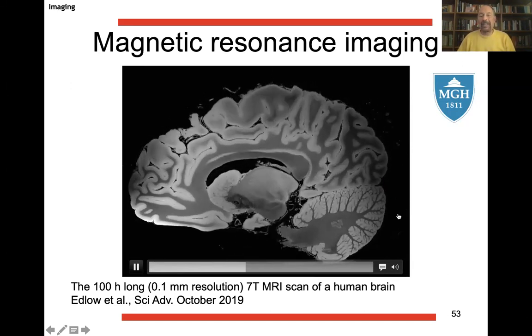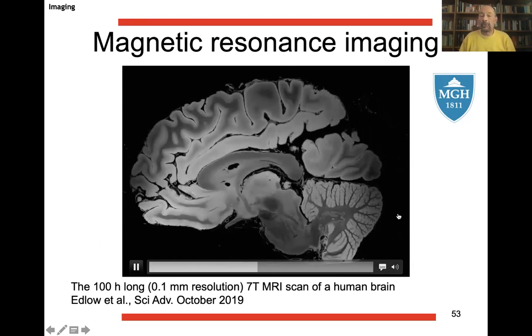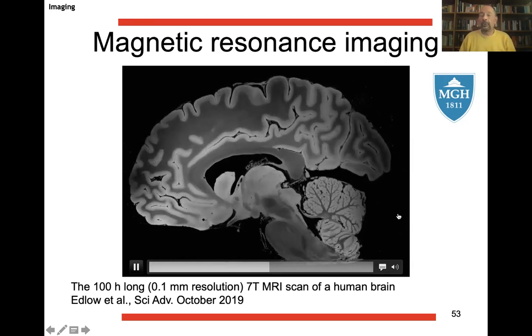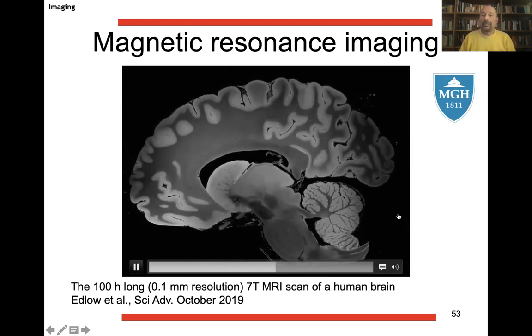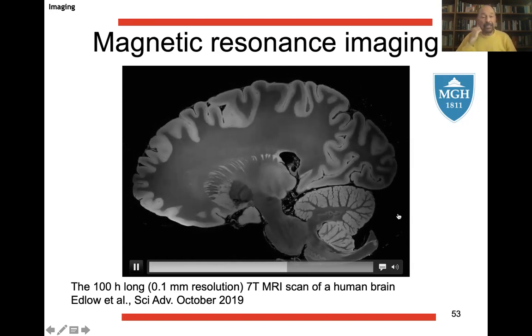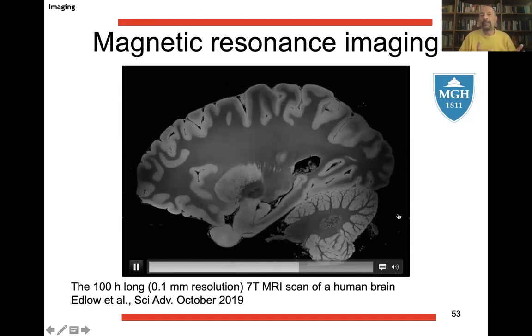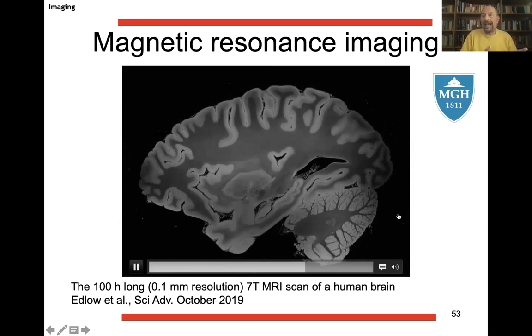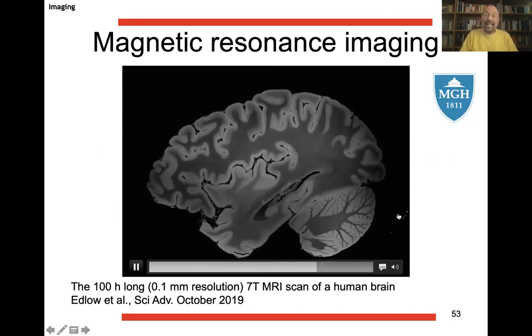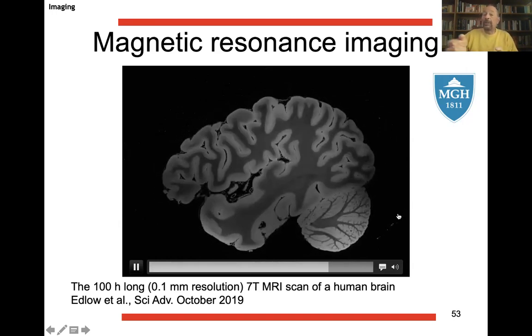So MRI is becoming more and more a leading technique in imaging, more and more used, more and more applied. There are also MRI linacs now where you can actually give radiotherapy together with MRI to follow the movement of the organs. The big difference is that, as much as radiography is good in visualizing bones, let's say hard tissue, because you use absorption of X-rays, MRI instead essentially only visualizes soft tissue and is particularly good in visualizing soft tissue.